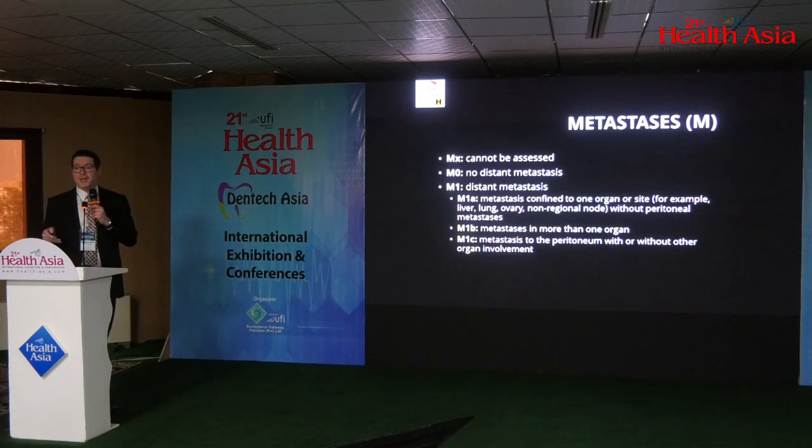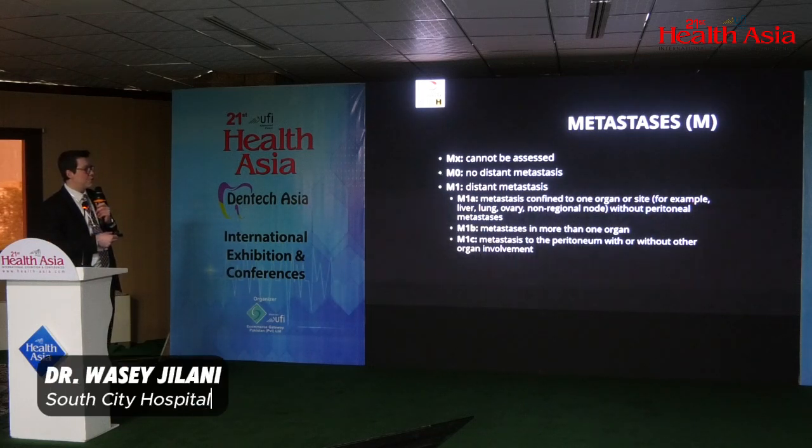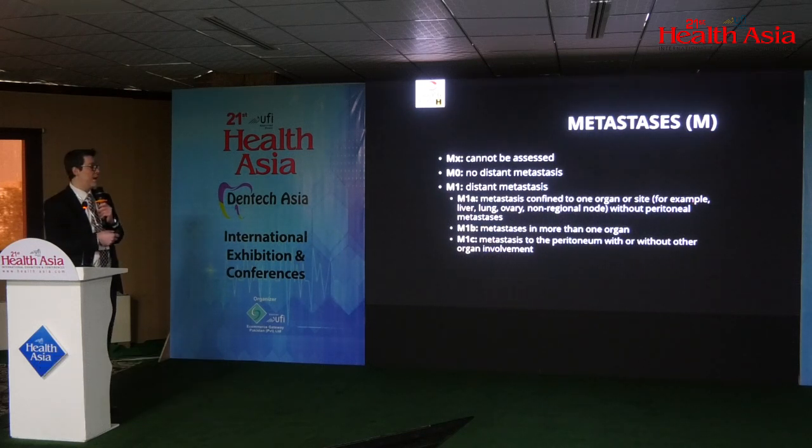As you move from the T and N stage, then you have the metastasis evaluation. Now, it's not necessary that that will be done on an MRI of the pelvis. A patient may already have had a PET scan or a contrast CT chest abdomen pelvis. That will help you in assessing whether the patient has metastasis or not. The moment you want to stage the disease, if assessment has not been done, you label it as MX. If the assessment has been done and there is no distant metastasis, the patient is M0. And if there is distant metastasis, the patient moves on to M1, which is subsequently categorized as M1A, B, C, depending on where it's spread.